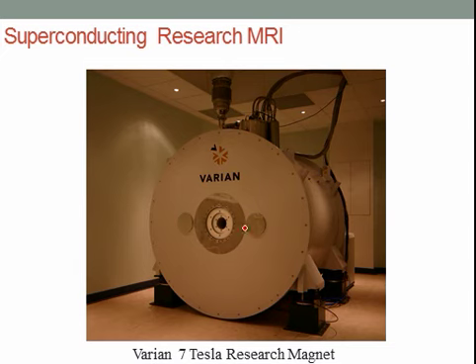So what you see in the middle is the bore here. In this machine, you have what are called gradient coil inserts. These white discs are different sized gradient coils. For example, this middle one, if I unbolt the appropriate bolts, I can slide this gradient coil right out, and then I have a larger gradient coil that I can then use to image maybe a larger animal.